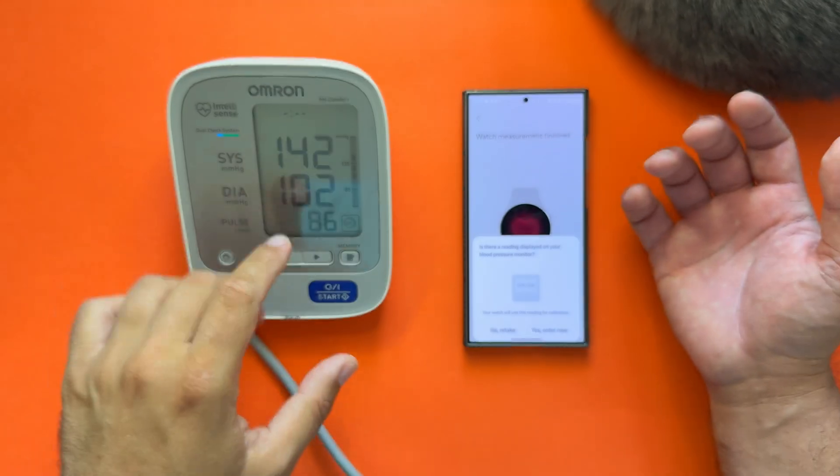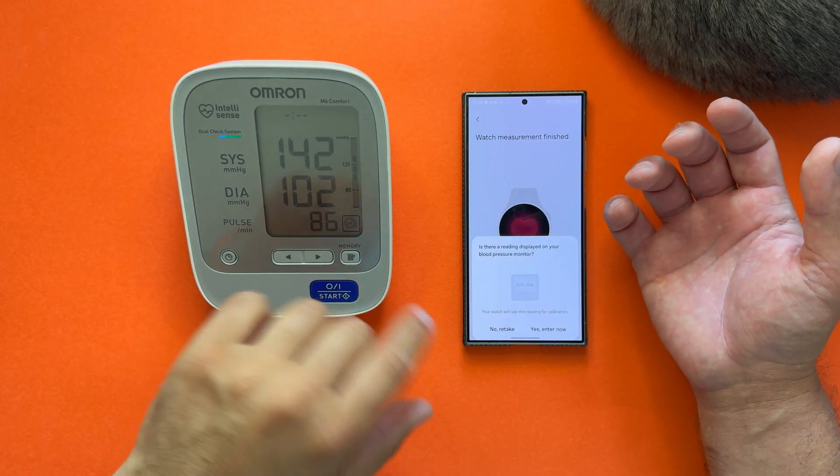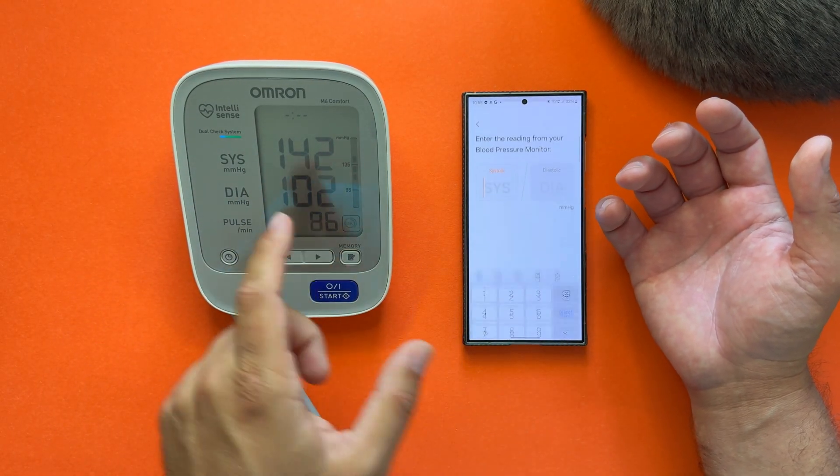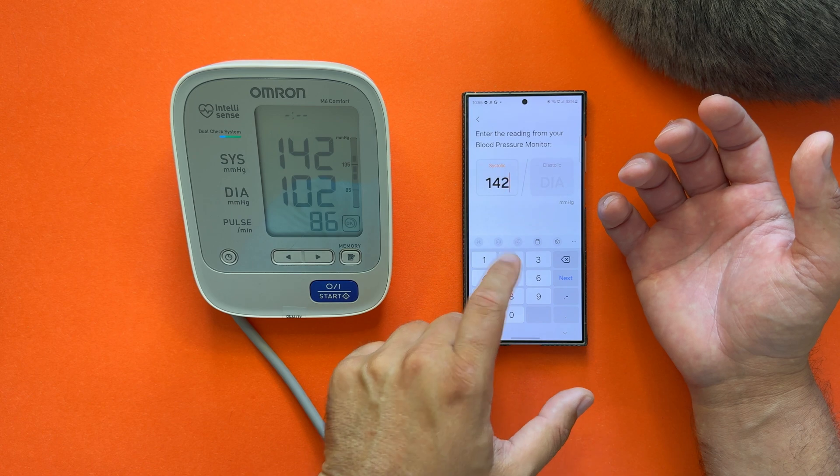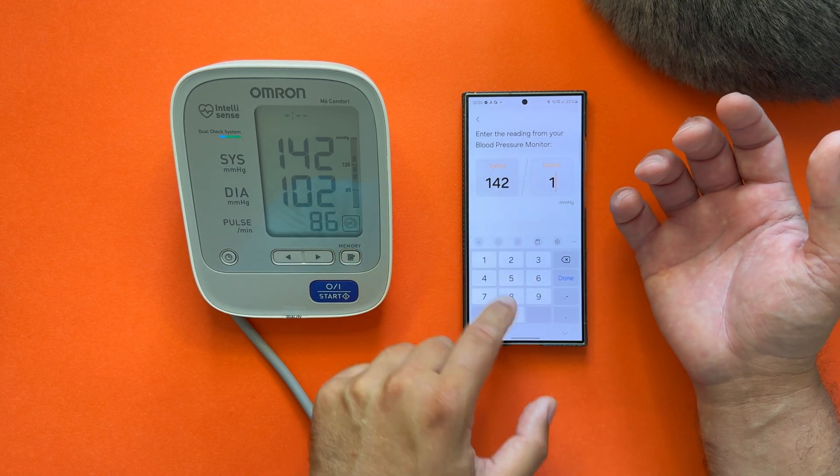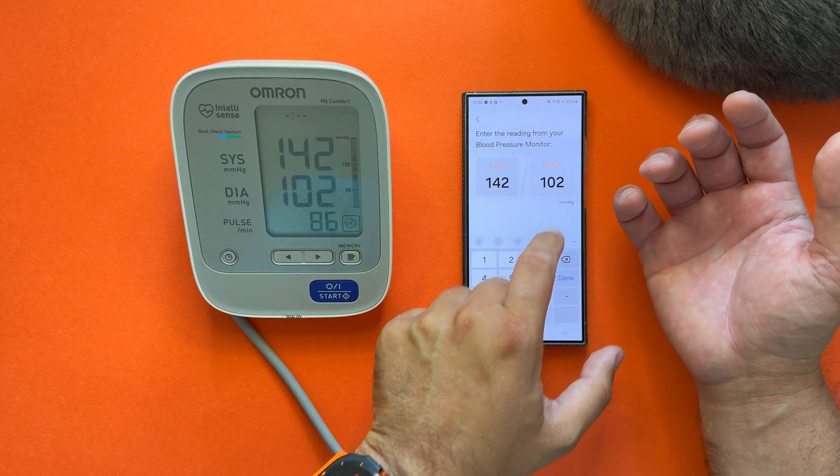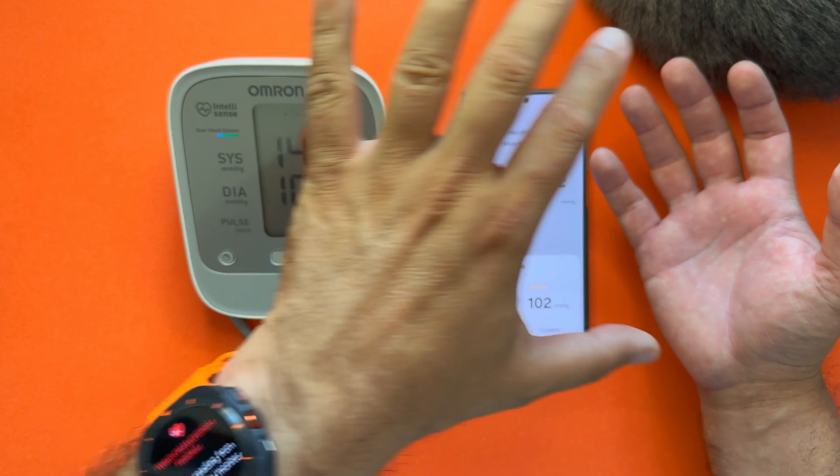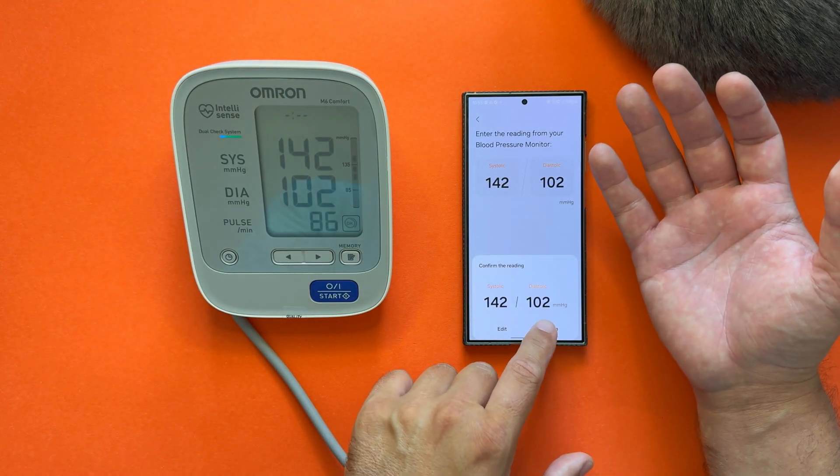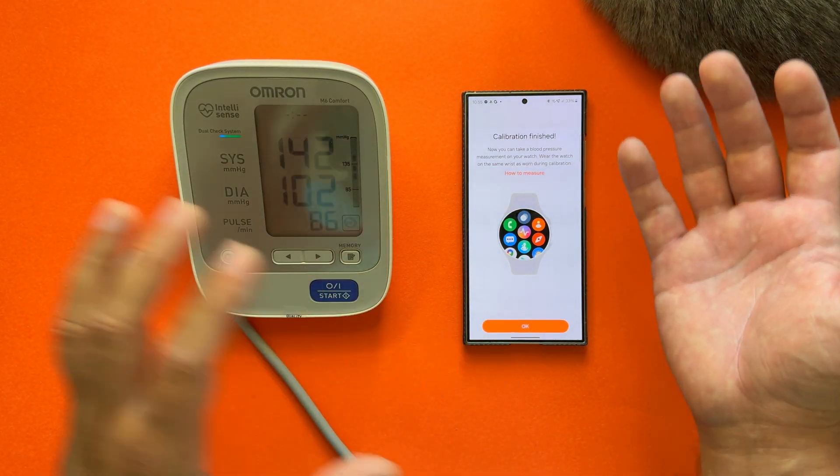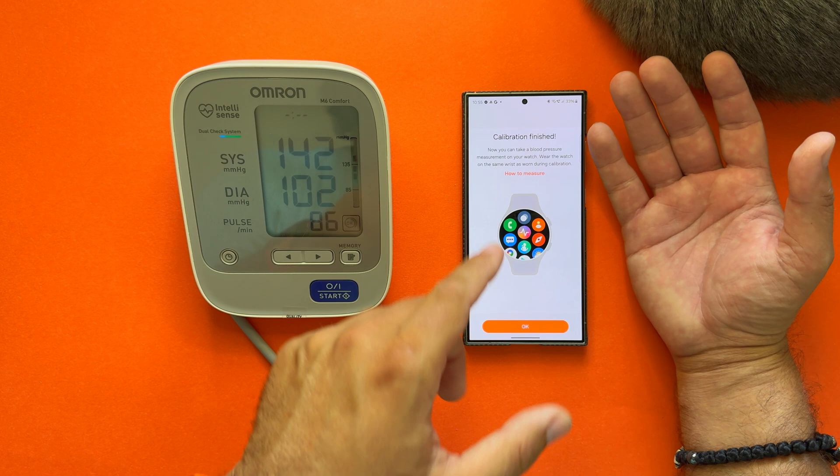All right, and now we're done. 142 over 102 with 86 pulse. I will now enter these numbers: 142 for the systolic and 102 for the diastolic. It's very important when you take those measurements not to move or speak. I'm going to press Confirm now, and now the calibration is finished.